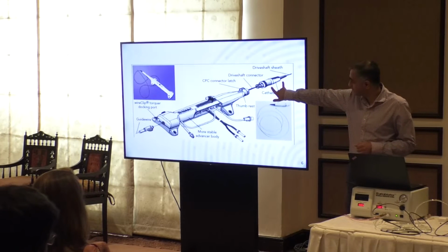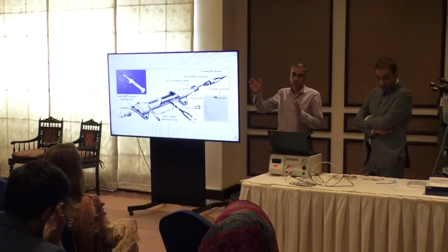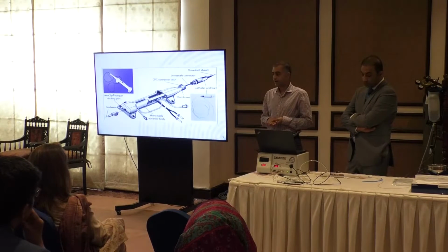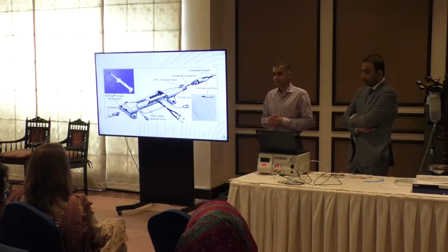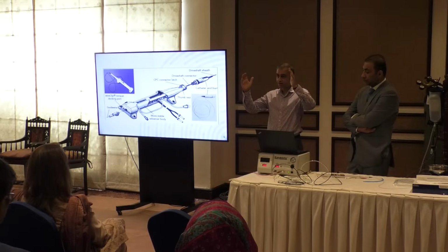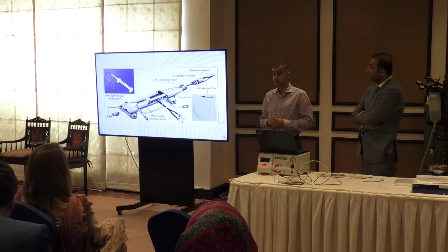So you then have the ability to change the actual catheter itself. Based on what you're seeing on the angiogram, you can choose which burr you want to go for. When rotablation first started, it's been around for a number of years, the general thought was that you should probably go for a burr to artery ratio of around 0.6, 0.7. I think things have changed now, and we'll probably aim for a burr to artery ratio of 0.5. So if you size the vessel and say, I think this is a 4 millimeter vessel, then you will probably aim to put a 1.75 or 2.0 burr into that vessel.